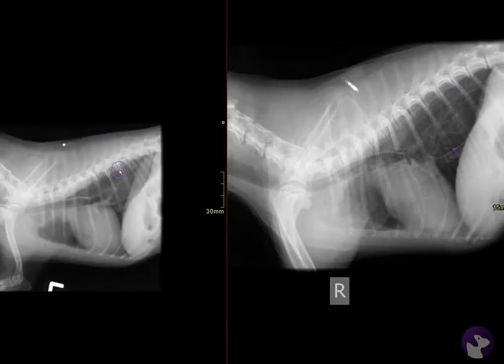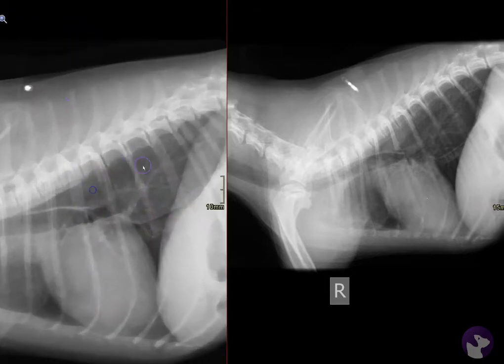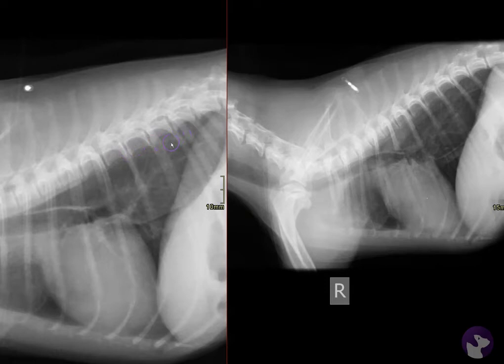One of the other things to note is what might be in the esophagus. In this instance, in our left lateral projection, we have just a little bit of fluid present. We've got that nice well-defined ventral margin, and that dorsal margin sitting up a little bit higher.